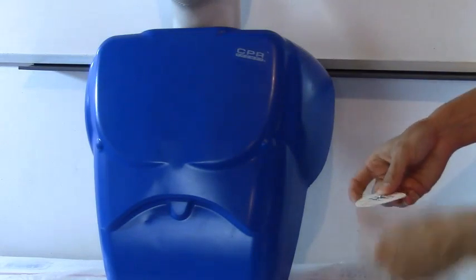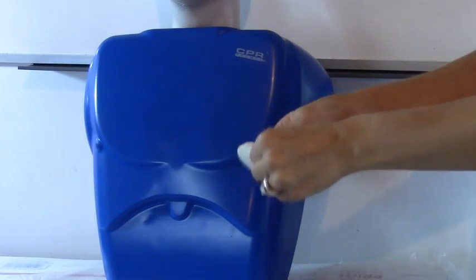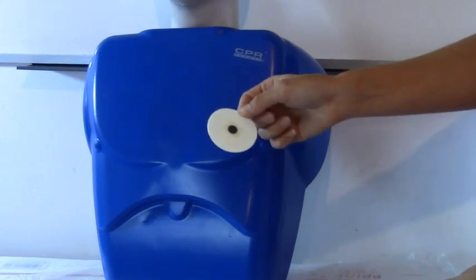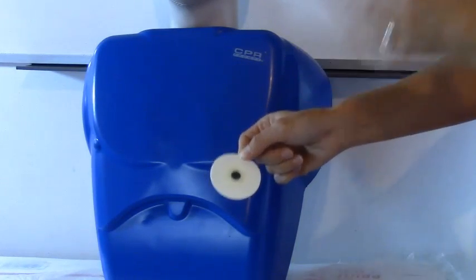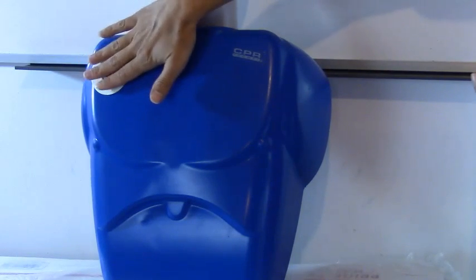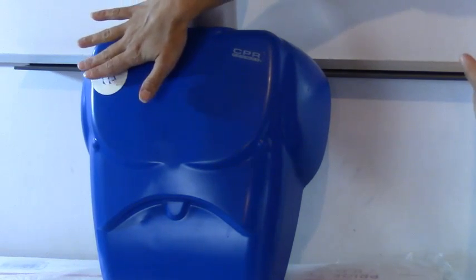So we've prepped and everything so what we're going to do is we're going to take the backing off of the electrode. Make sure these are not dry. Make sure they're nice and lubricated because if they're dry you'll get artifact and you're just going to put it on the skin and make sure it's nice and flush on it.